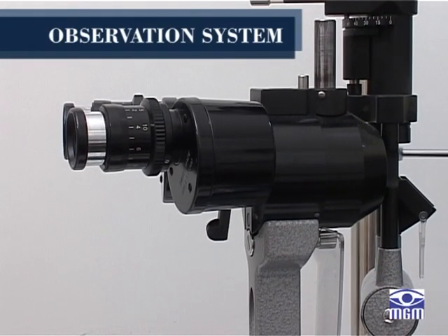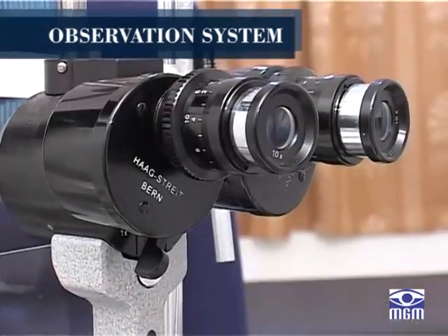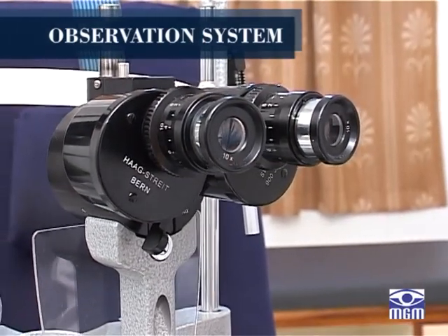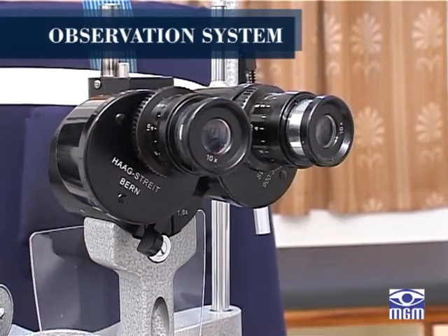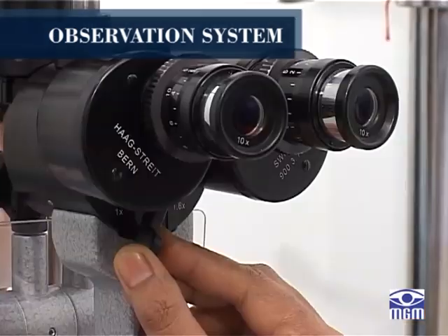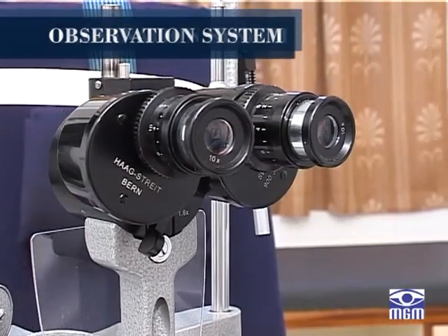This magnifies the eye and the slit image. It is composed of two optical elements, an objective and an eyepiece. The slit lamp microscope produces an effective range of magnification with excellent resolution, which utilizes optical changes, interchangeable oculars, or both.